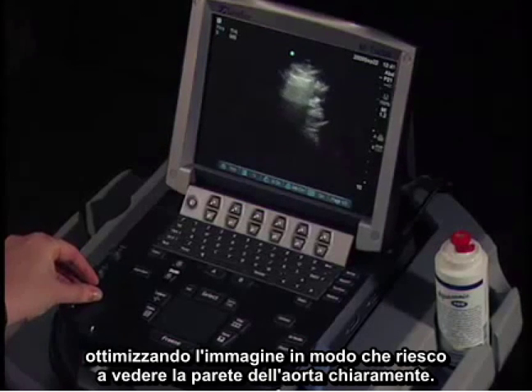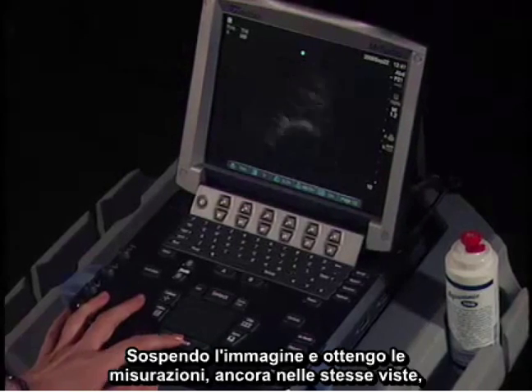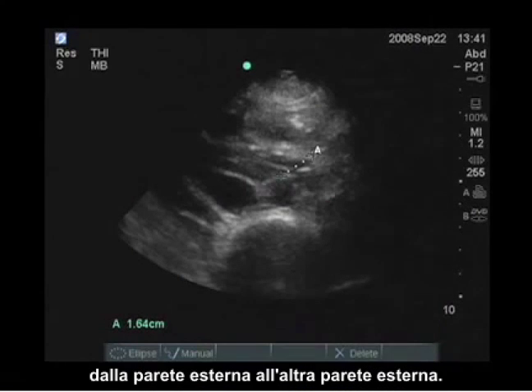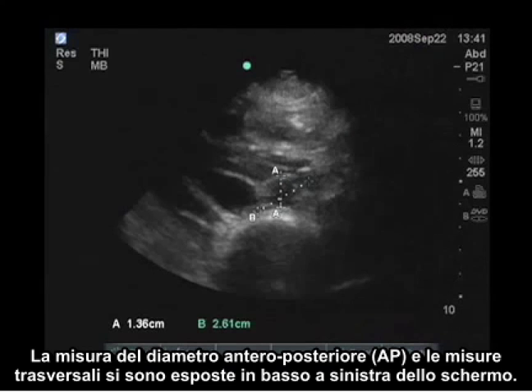Optimizing the image so I can see the wall of the aorta clearly. I will freeze the image, perform my measurements, the same 2 views again, from outside wall to the outside wall. That's the AP measurement, and the same with the transverse.